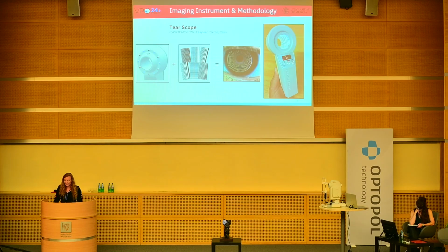This device is located as closely as possible to the ocular surface to have the placido disc cover as much ocular surface as possible. The pattern will distort in time after the subject stops blinking, and is captured and then quantified by analyzing its deformations. So the main objective of the present study is to use the dual imaging instrument to investigate the potential relationship between the ocular surface temperature and the deformations in the placido discs.